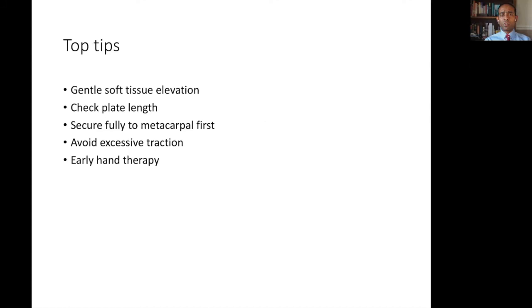Top tips to improve your outcome involve ensuring that you judiciously elevate soft tissues using your periosteal elevator — try not to strip too much. This will allow the plate to follow a predestined course and help with accurate placement. Always check the plate length before you start to ensure it's sufficient to bypass the zone of injury. It's important to ensure that you have at least three screws proximally and three screws distally to give enough stability to your construct. My preferred technique is to secure the plate to the metacarpal first fully with all its screws, then once secured, to apply traction before securing to the radius. This can be a very powerful way of adding traction to your construct. One must make sure not to apply excessive traction, as this will give some of the downsides seen with external fixators, such as tight tendons and CRPS secondary to median nerve problems. Key to success with these cases is early hand therapy.